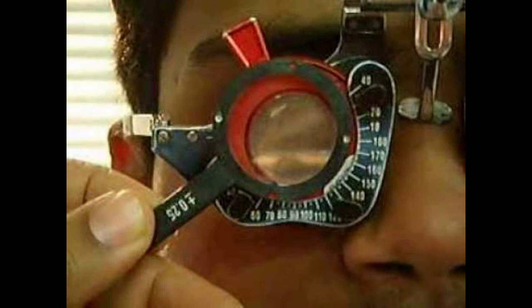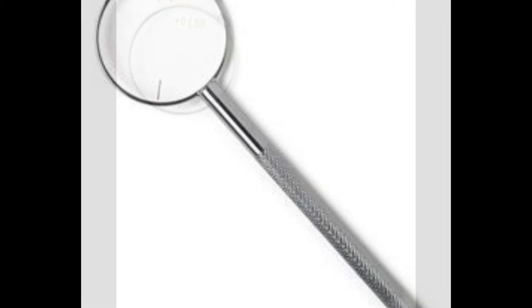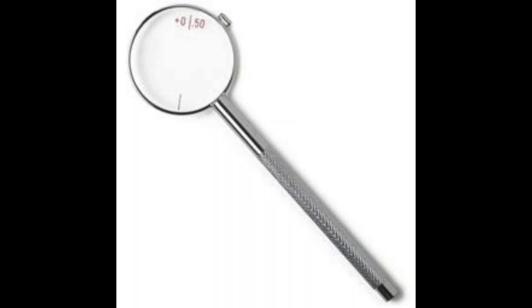Remember, if you're using a plus/minus 0.50 diopter Jackson Cross Cylinder, the real change of flipping is one diopter, and the patient will definitely notice the change. Remember, you have to choose the correct power of the Jackson Cross Cylinder for each patient depending on their current vision.